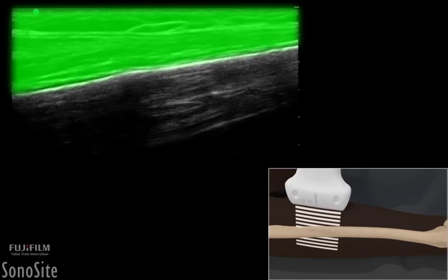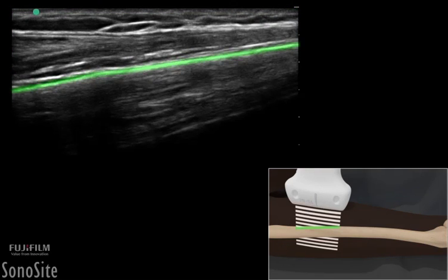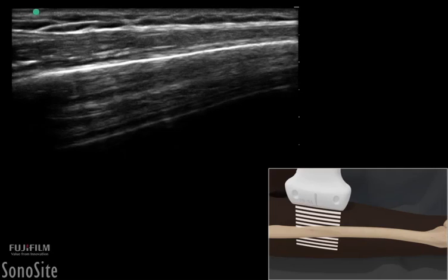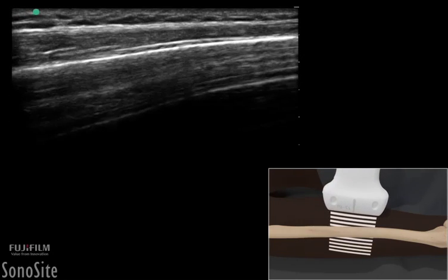The fatty soft tissue above the bony surface appears hypoechoic. The surface of the bone appears as a bright, hyperechoic line that is smooth and without deformities. The transducer should be slowly translated down the entire surface of the bone.